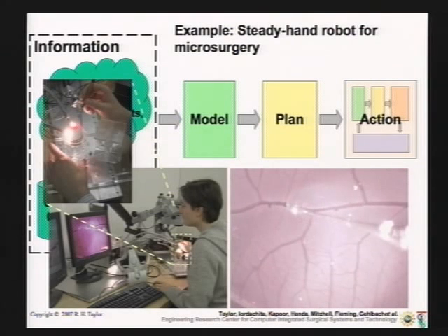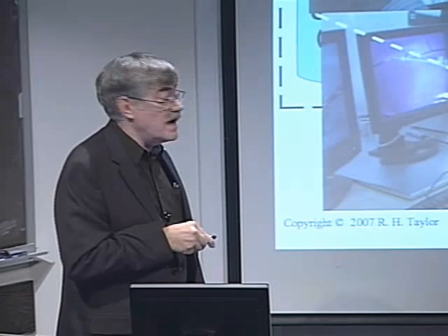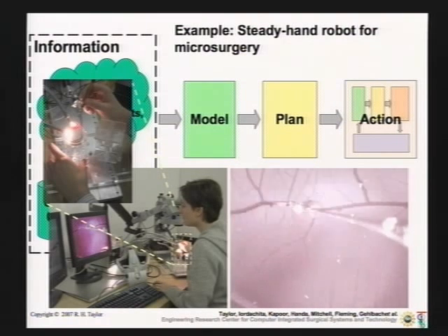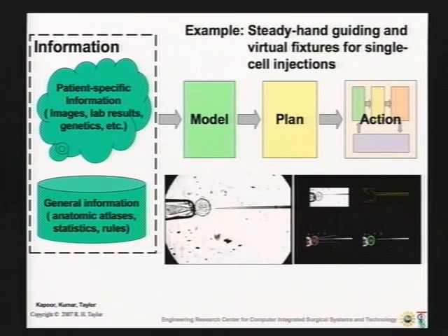One of the applications we've been exploring with this has been cannulation of retinal vessels. I believe it's the second most common cause of vision loss from a problem in the retina: a blood clot in your eye. And the blood clot is in a blood vessel about the size of the hair on your head. So the hypothesis is if you could reliably and quickly and with a routine surgeon insert a needle into the blood vessel, you can inject something that would dissolve the clot. There's been a lot of interest in this, but especially in these smaller vessels, it's just not practical without some kind of an aid. So we've been using this application and another one of peeling epiretinal membranes to drive our research. You can actually take the same idea, even a scale smaller.